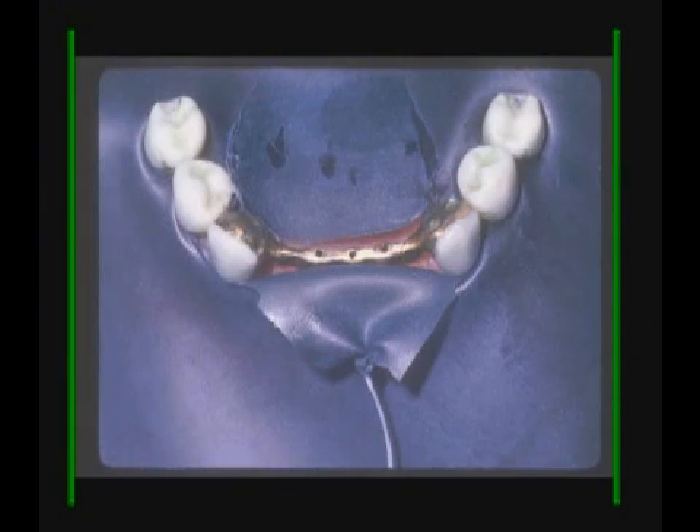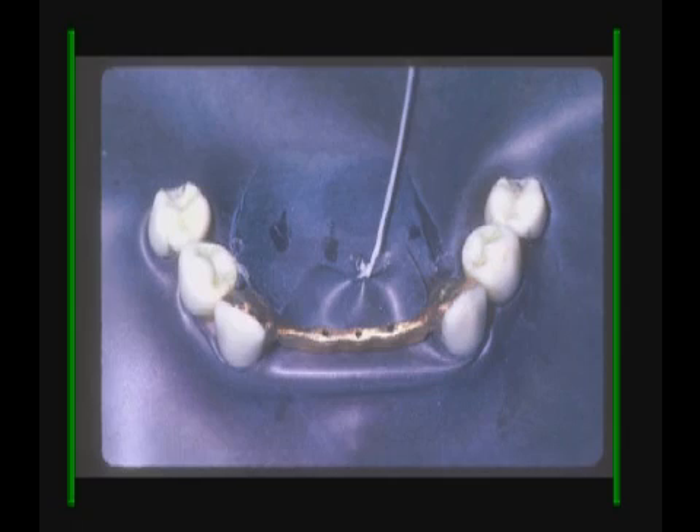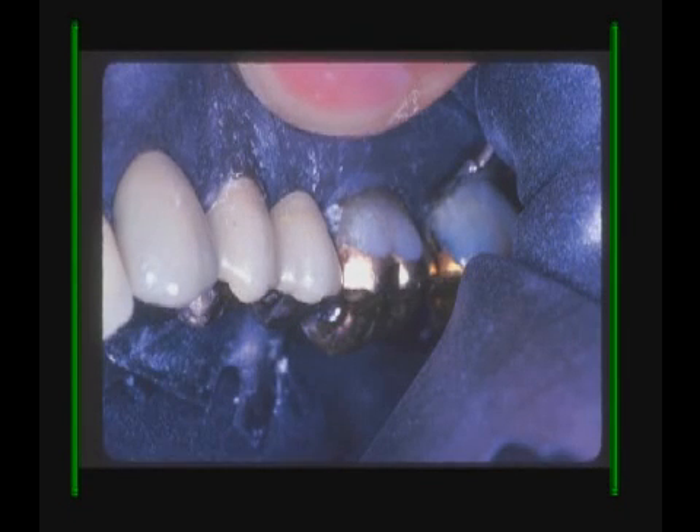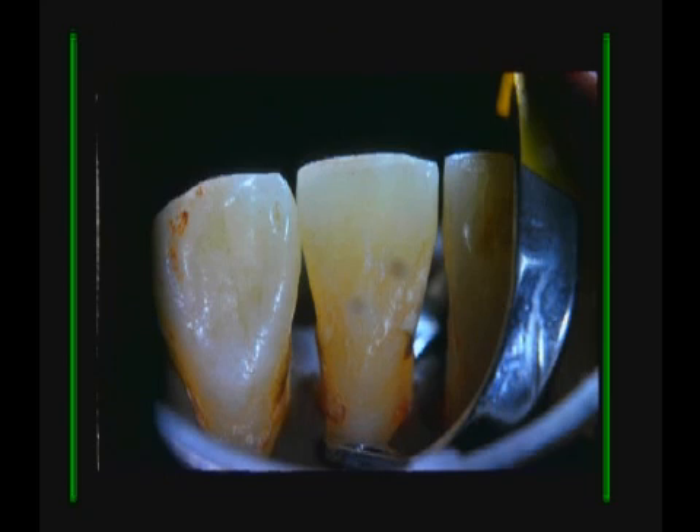The dam is applied to the teeth and the floss is threaded underneath the fixed component and the flap is pulled through underneath. The second premolar is a pontic and the rubber dam has been applied underneath that pontic, giving you excellent access to restore either tooth. The easier and better way to go is simply by putting rubber dam on a proper tissue retractor that will go to the depth of the sulcus.